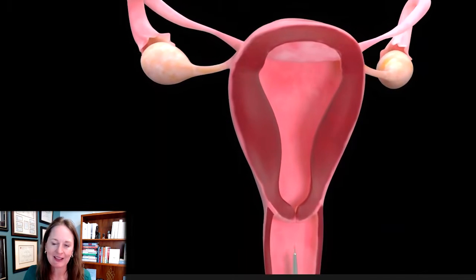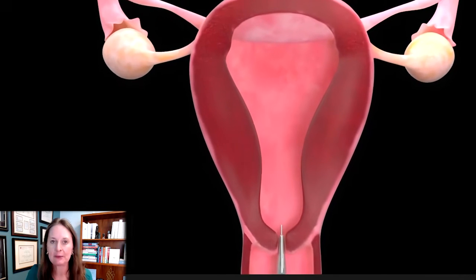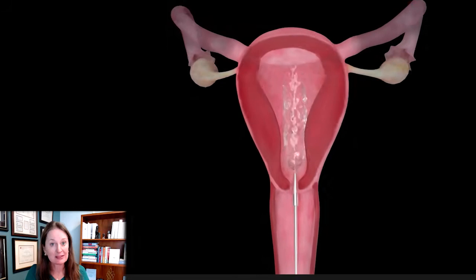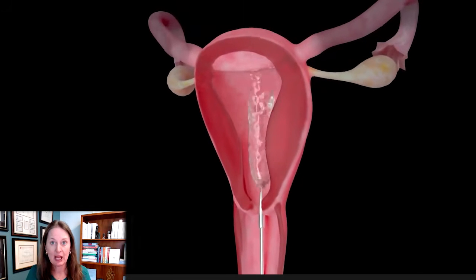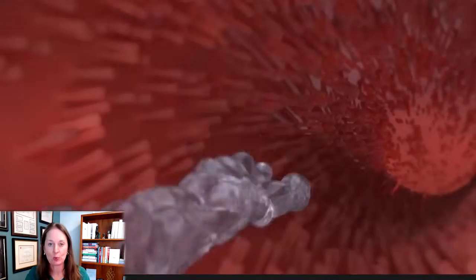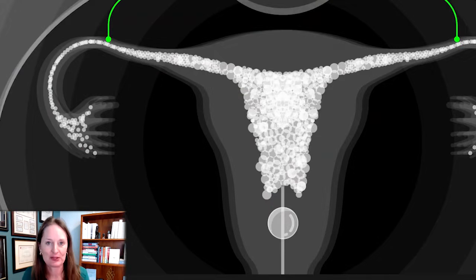We call it dye. It's actually clear, but it's just called dye because with fluoroscopy, this is the special equipment, you're taking images, like X-ray images of the uterine cavity and area as you're watching the dye go into the uterine cavity and spill out through the fallopian tubes.